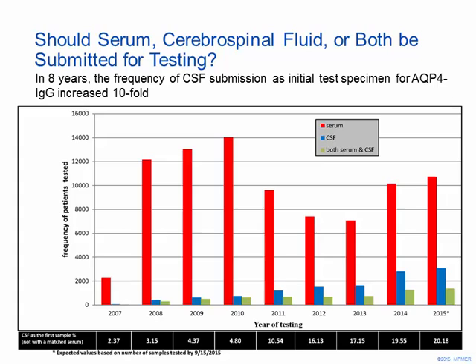The next question that I'm hoping to answer is, what specimen should be submitted? Should you submit serum? Should you submit cerebrospinal fluid? Or should you submit both for optimal testing for aquaporin-4 antibodies? I think this is important because there has been an increased drive to try and get clinicians to submit spinal fluid for evaluation of encephalopathy. For example, we now know that NMDA receptor antibodies are probably more sensitively detected in CSF than in serum.